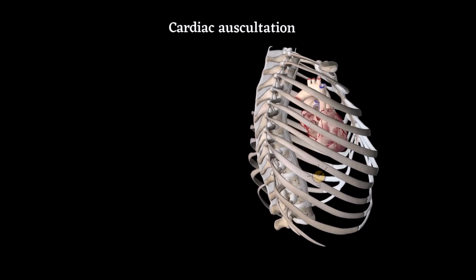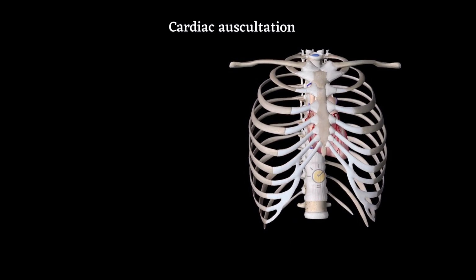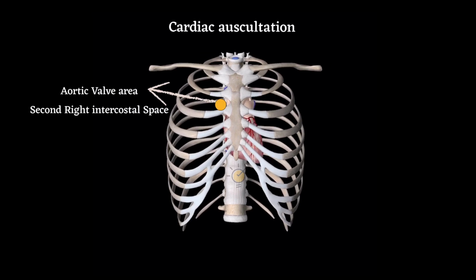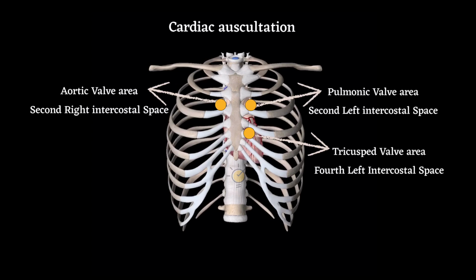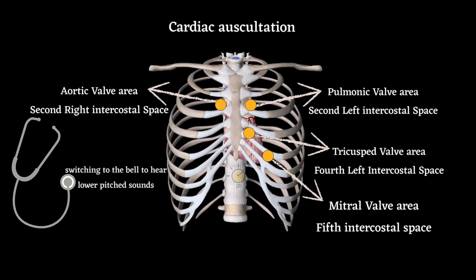Cardiac auscultation is performed systematically over four main locations on the anterior chest wall: the aortic valve area, which is the second right intercostal space; the pulmonic valve area, which is the second left intercostal space; the tricuspid valve area, which is the fourth intercostal space; and the mitral valve area, which is the fifth intercostal space, left mid-clavicular line. Use the stethoscope's diaphragm, switching to the bell to hear lower pitch sounds.